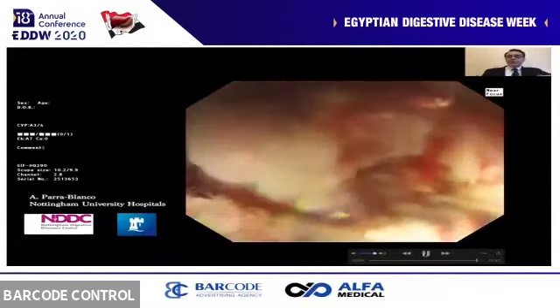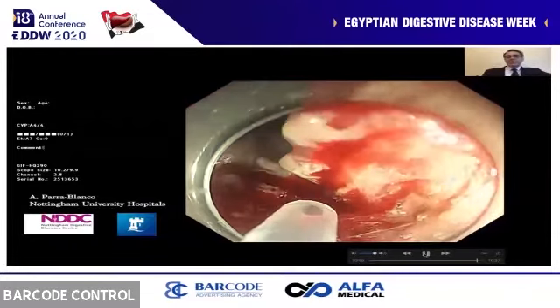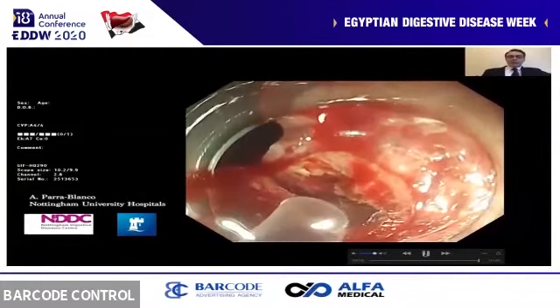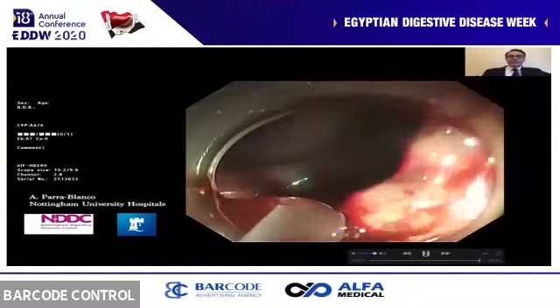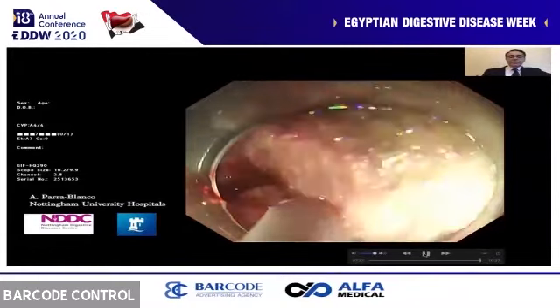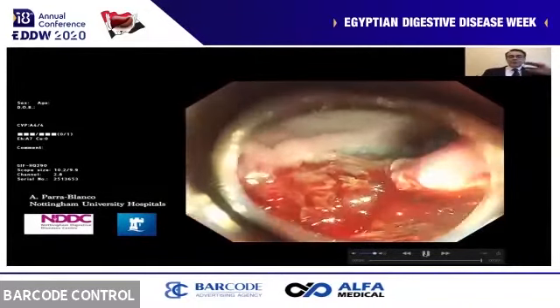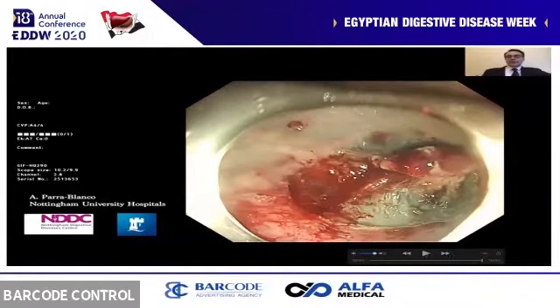There's further bleeding. The lesion is attached to the muscle layer, and I prefer now to use a Purastat. It is the hemostatic gel, as you know, which can be used to treat intraprocedural bleeding or decrease the rate of delayed bleeding on post-resection ulcers. It is formed by a synthetic polypeptide, which forms a scaffold on the tissue. And we managed to continue the dissection.